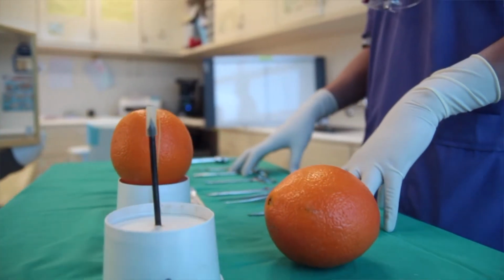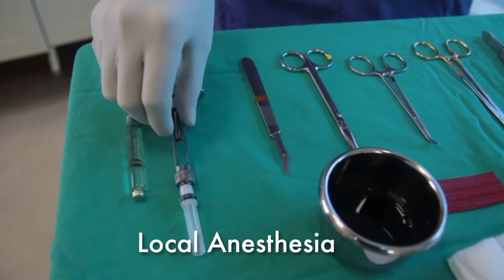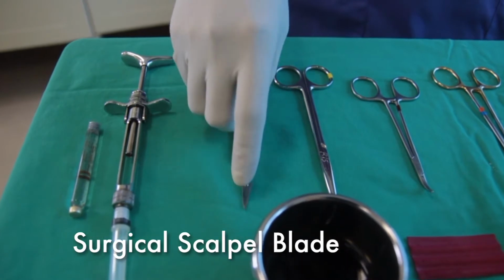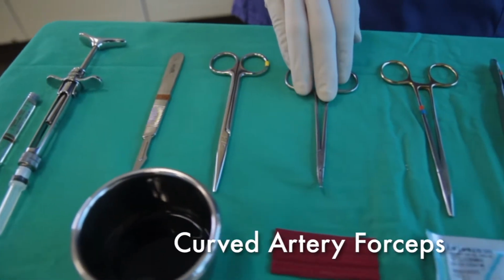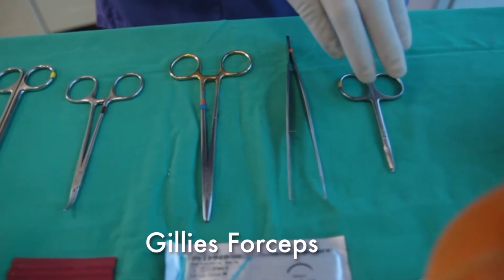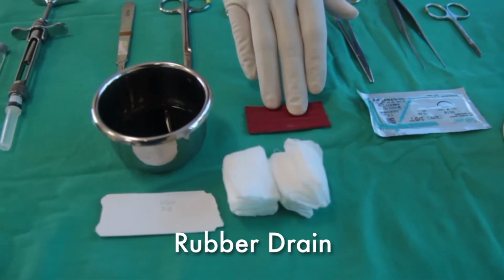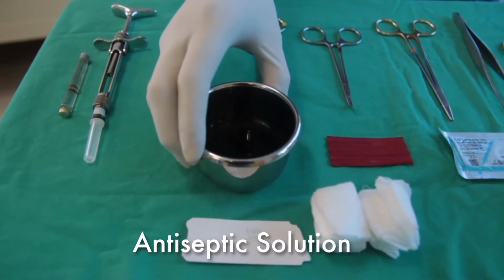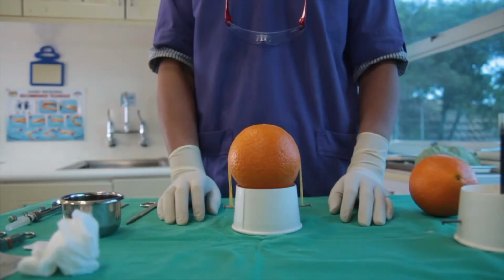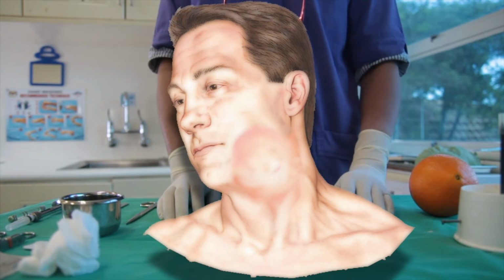For the IND procedure, since it's going to be done under local anesthetic, you're going to need at least a cartridge of LA with a syringe, scalpel blade, preferably blade number 11, which is pointy, scissor, curved artery, needle holder, Gillies forceps, suture scissors, non-resorbable suture, rubber drain, antiseptic solution which is the povidone, and of course some gauze for the dressing. For the purpose of this demonstration, we're going to imagine the orange as a left submandibular abscess.